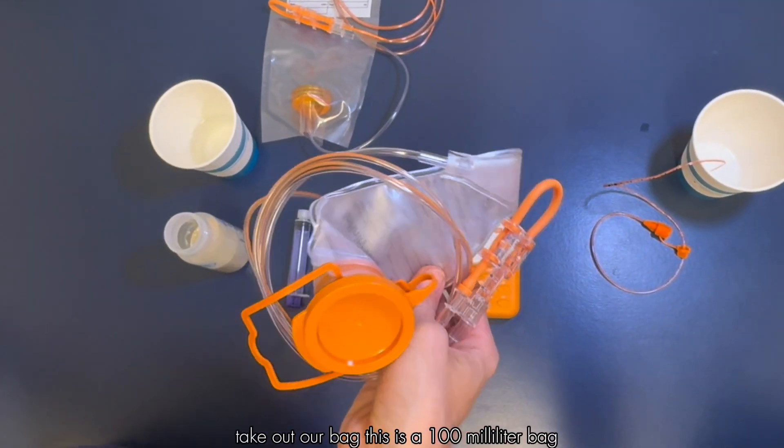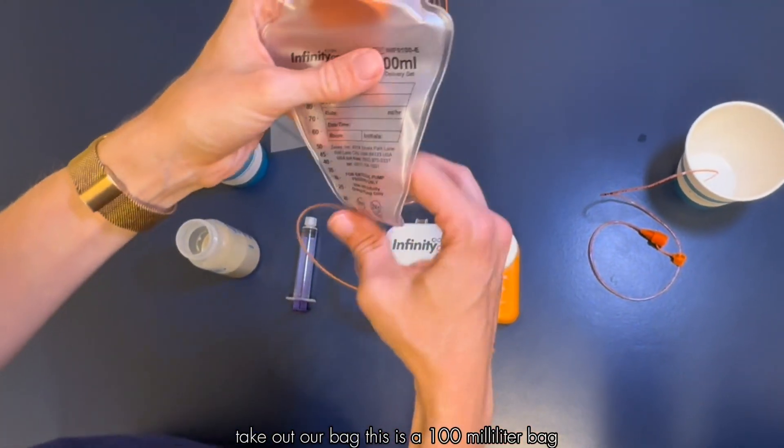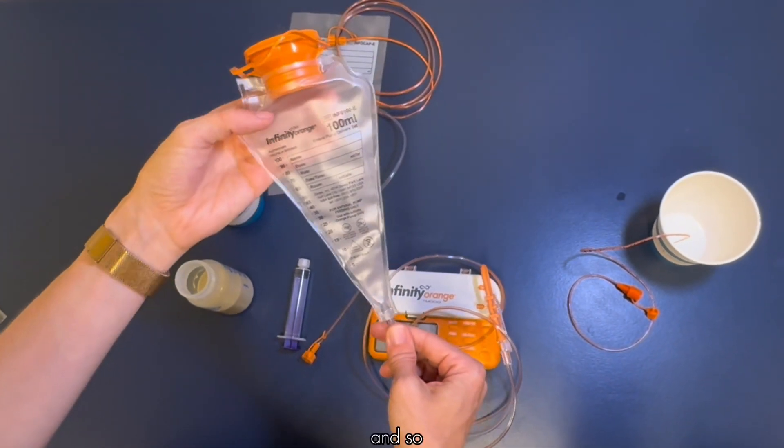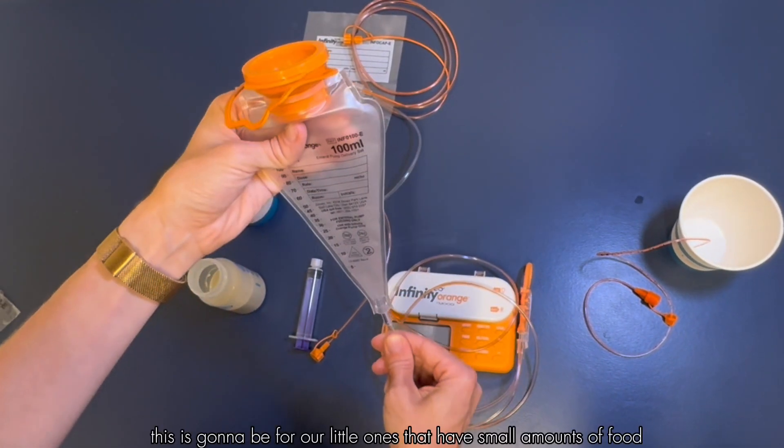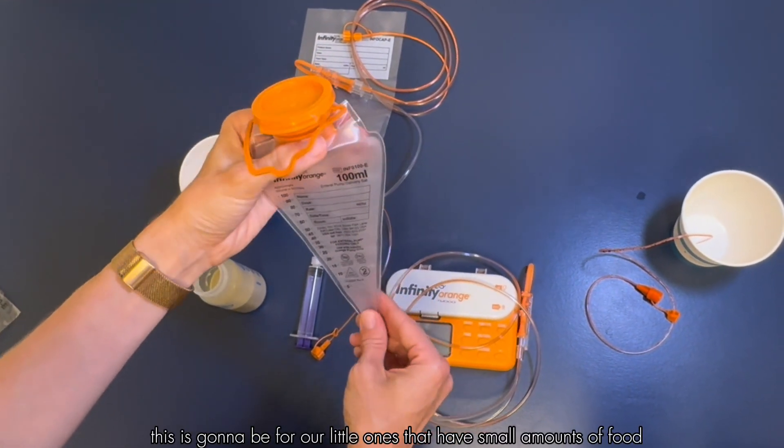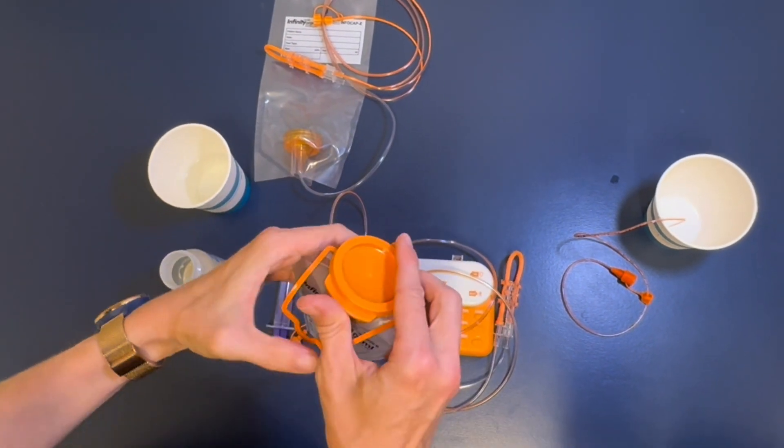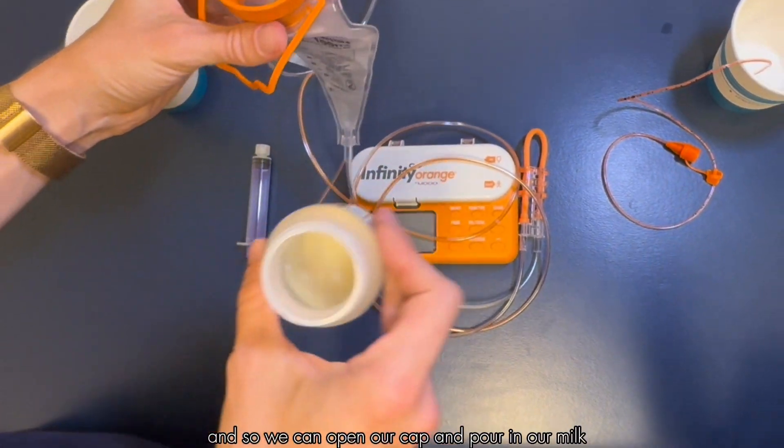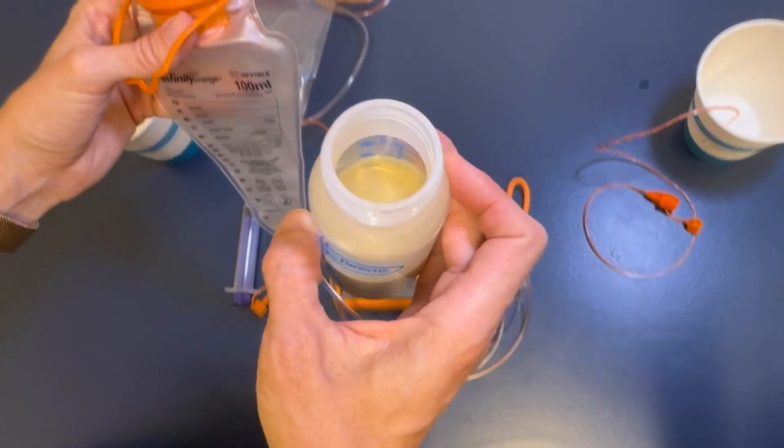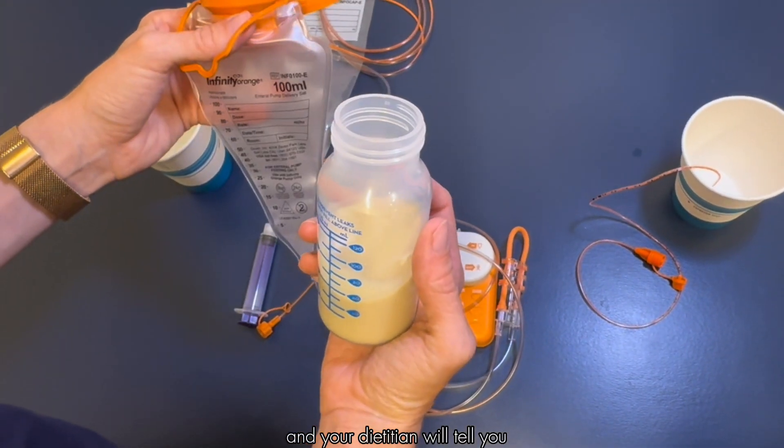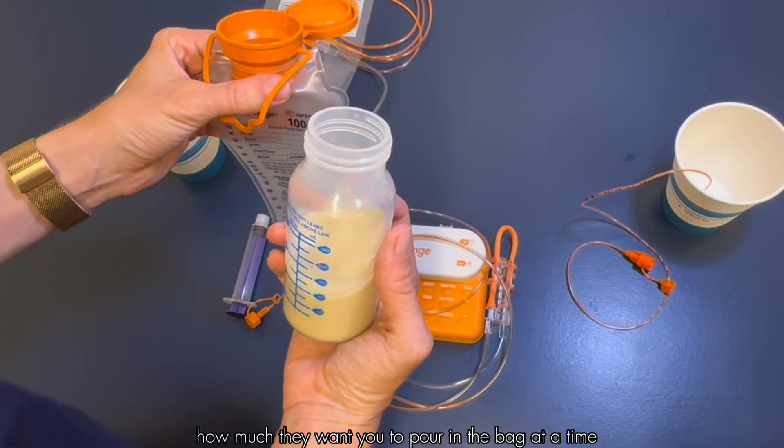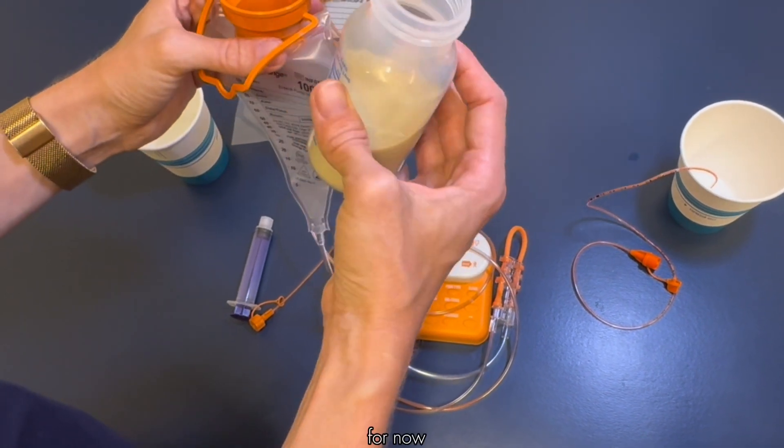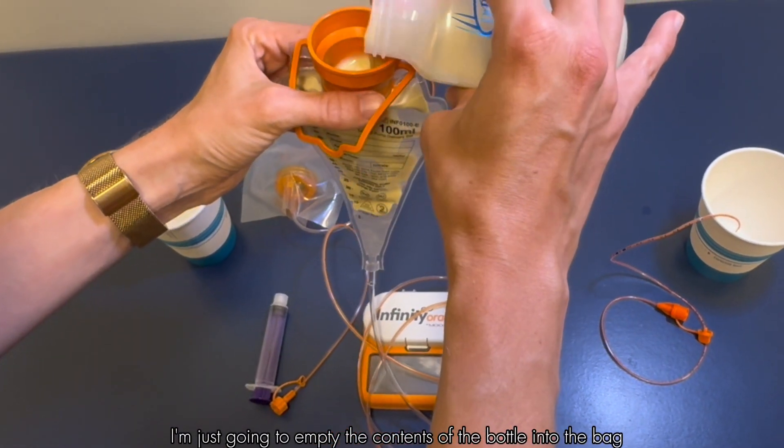We can open the packaging, take out our bag. This is a 100 milliliter bag so this is going to be for our little ones that have small amounts of food. We can open our cap and pour in our milk, and your dietician will tell you how much they want you to pour in the bag at a time. For now I'm just going to empty the contents of the bottle into the bag.